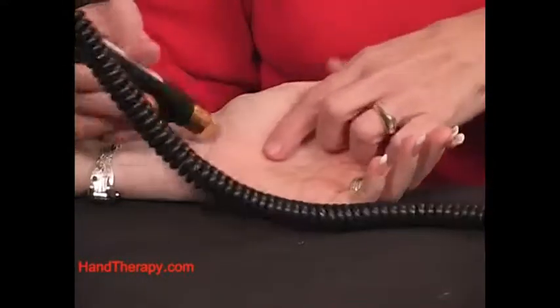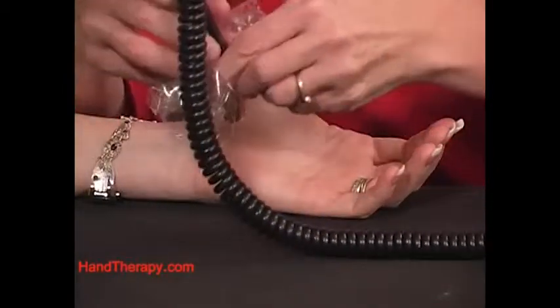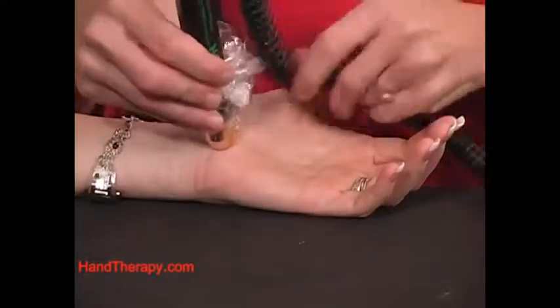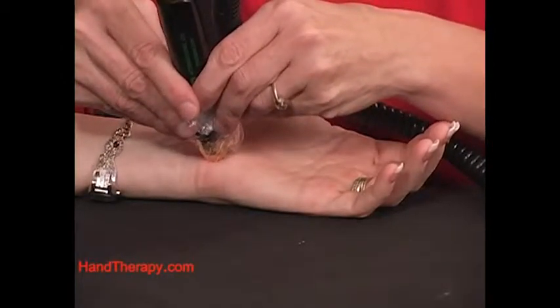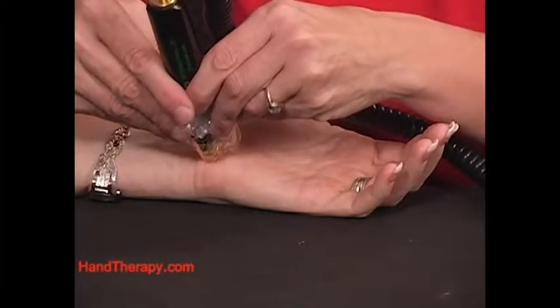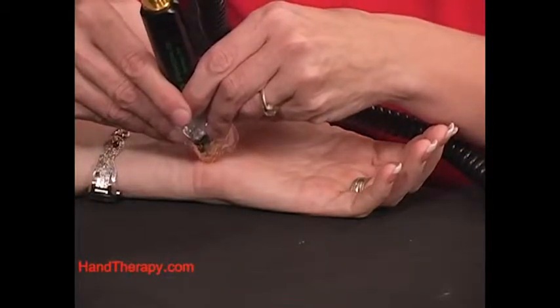So we're at post-op pain. She had carpal tunnel and she has pain. So what I'm going to do, let's say she's seeping a lot, then obviously I could do my cellophane trick. I could put the probe on her, and I'm going to put my beam on, and then I'm going to hold that there for a good 20-30 seconds, and I am going to be doing this too at about 20 hertz.